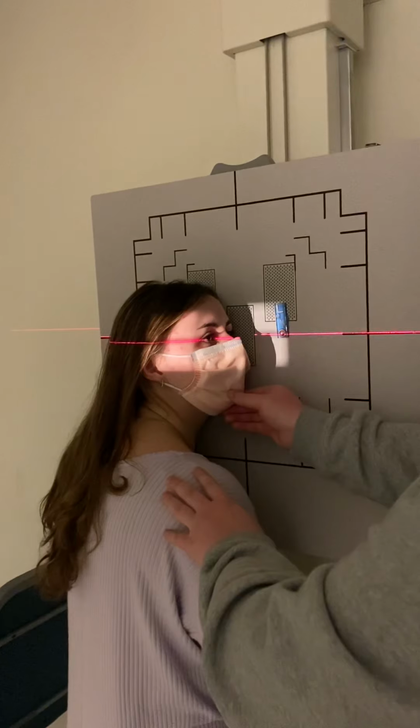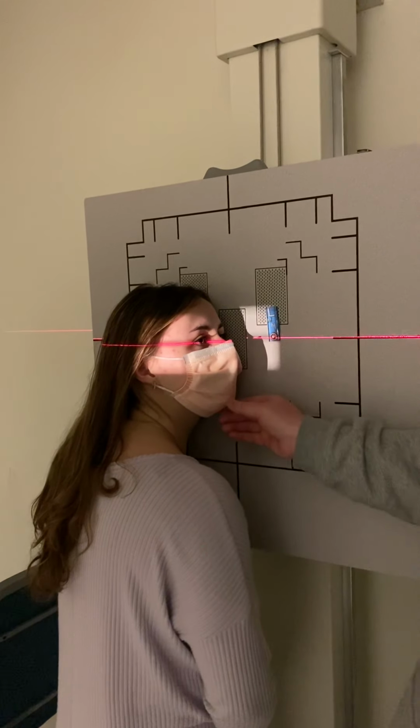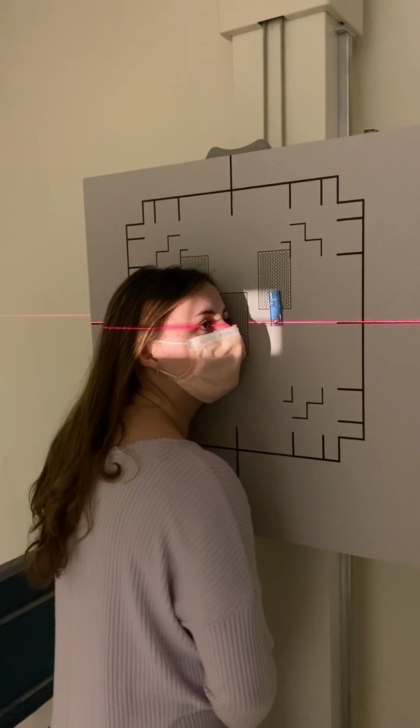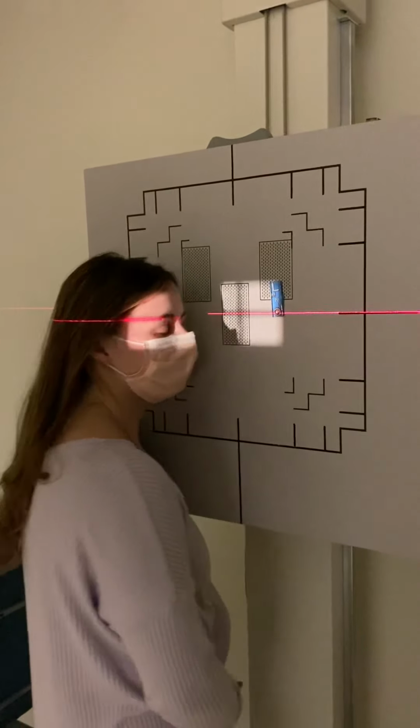And then we're going to keep her as still as possible. And when she's looking at that point on the wall, I'm going to tell her to hold her breath, and then I'm going to shoot. Beep. All right, you can relax.